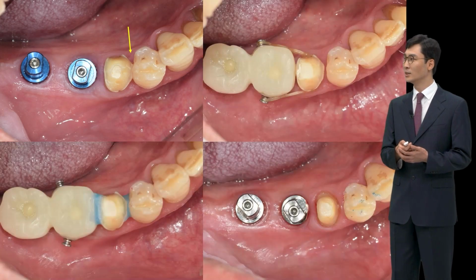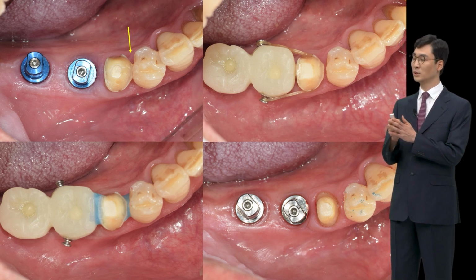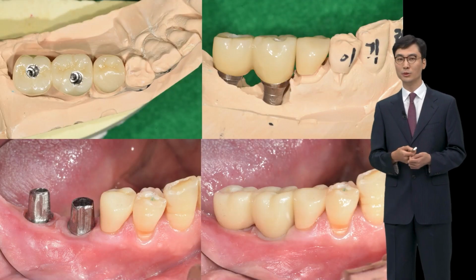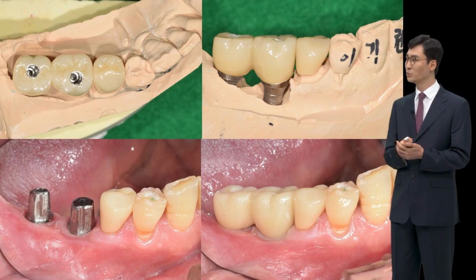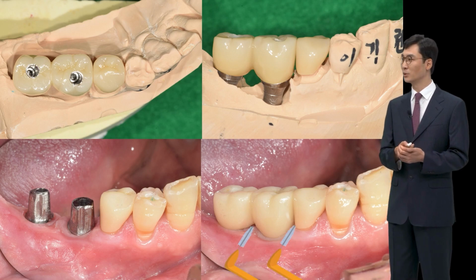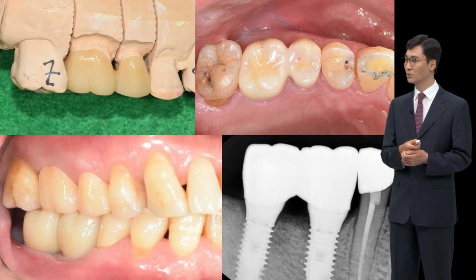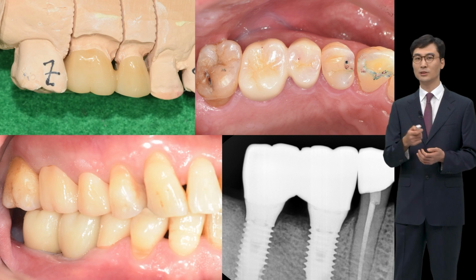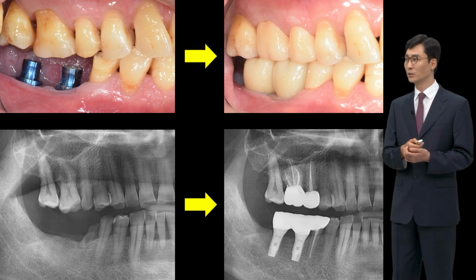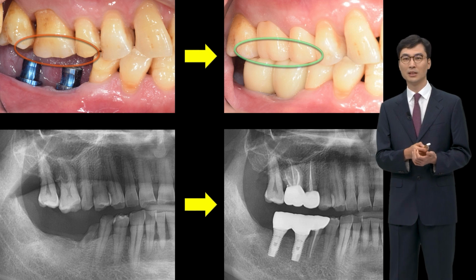That completes the surgery. After the treatment, impression was taken to do prosthetic work on the natural tooth, which was moved a little bit, and impression was taken and final prosthesis was mounted. The final prosthesis should be designed to have a space between an implant and a natural tooth or between implants for interdental brush. As the opposing natural tooth was fractured and extruded, it was restored, so the plan to have harmonious occlusal function between the upper natural tooth and lower implant prosthetics was carried out.